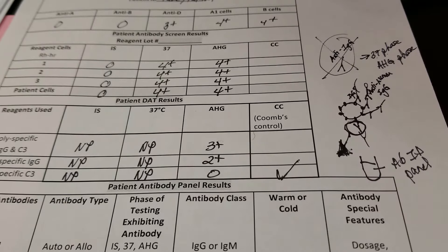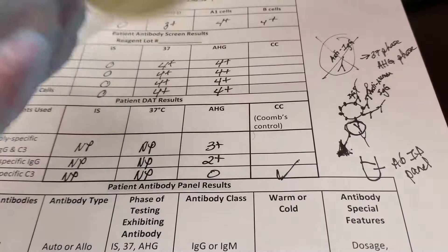We're going to test the eluate against an antibody identification panel. I'm not actually going to do the antibody identification panel in this video because we've done an antibody ID panel before, so you know what that process looks like. I'm just going to show you how to actually do the elution today.